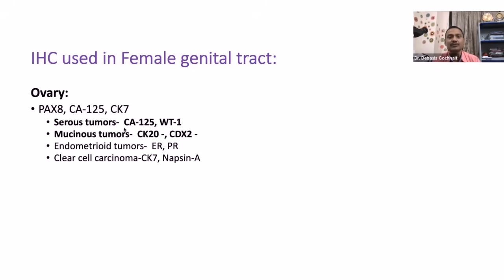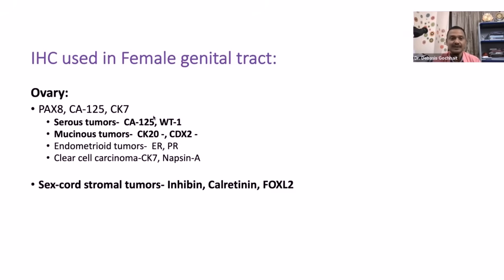Okay. When we talk about mucinous tumors, now mucinous tumors can be primary or metastatic. The metastatic ones will be positive for CK20 and CDX2, whereas the primary ovarian mucinous tumor will be negative for these two markers. Okay. So here at least you must remember serous ovarian carcinoma.